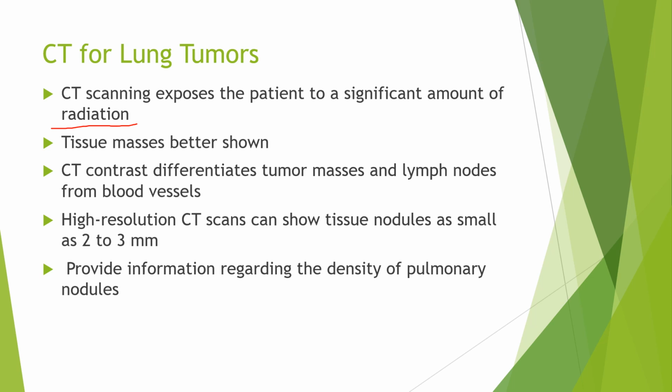And they're going to dose the radiation per the size of the patient. So if you're in a room with a small neonate, a newborn that's barely 500 grams, then you're not going to be exposed to as much chest x-ray radiation as you would with an adult that weighs 150 pounds, right? You're going to use more radiation for that type of situation. So understand the bigger the patient, the more radiation they have to use.